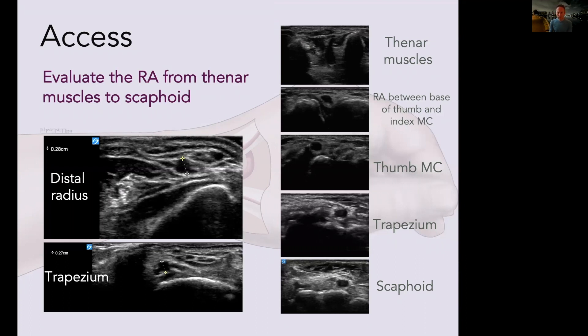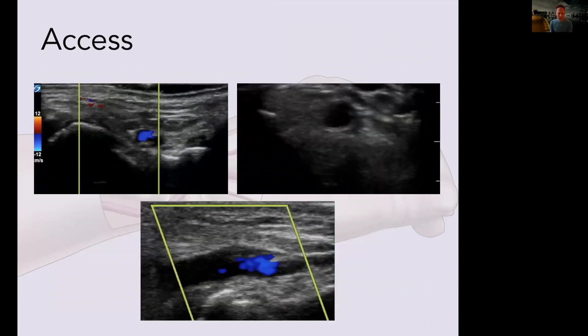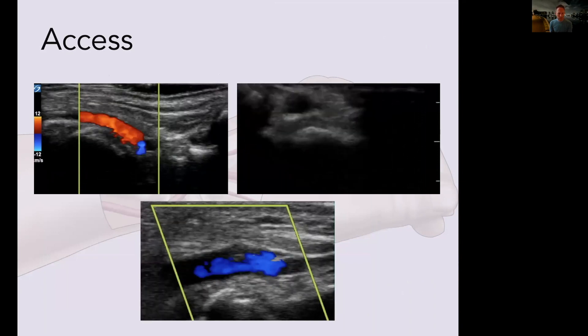Going through the landmarks: starting very distal in the interosseous muscles, you can see some thenar muscles as well. Moving more proximal to the base of the metacarpals, you don't really want to puncture here because you can easily puncture between the metacarpal heads. The base of the thumb metacarpal can be very osteoarthritic, particularly in post-menopausal females. This is ultrasound Doppler showing the artery moving over the distal radius and down onto the volar side of the wrist.